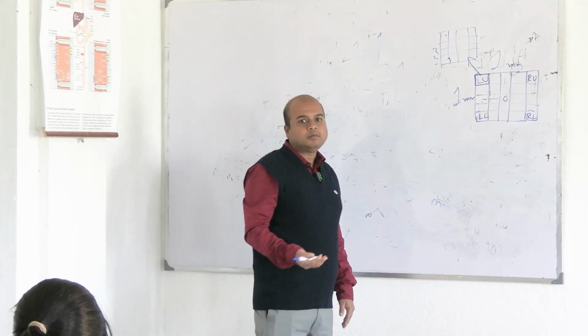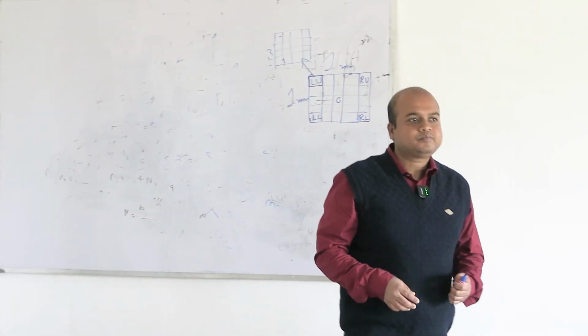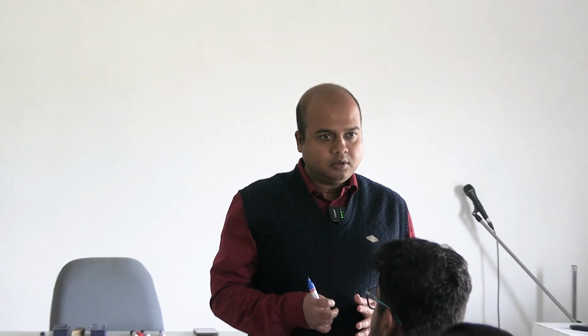So why these 4 corners and 1 central of the medium squares? Again, apply some sense. We are considering uniform distribution. If it is uniformly distributed, then whatever the density of cells in a corner would be the density of cells in the central.